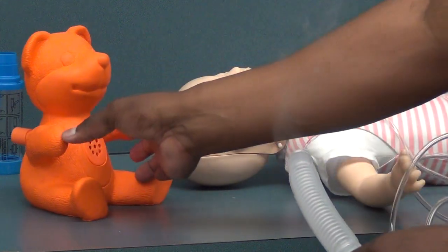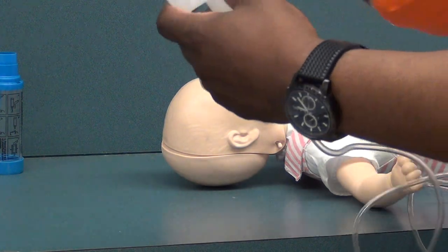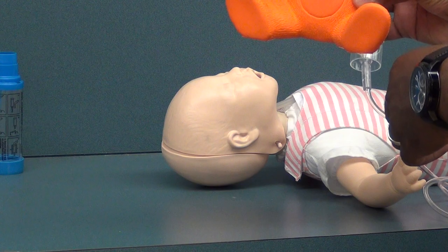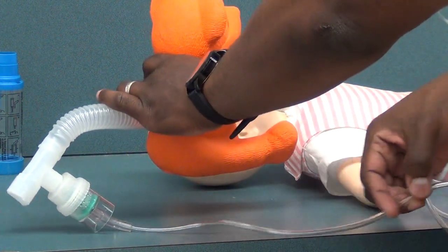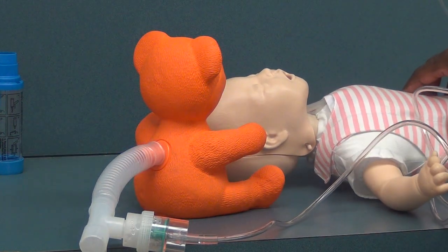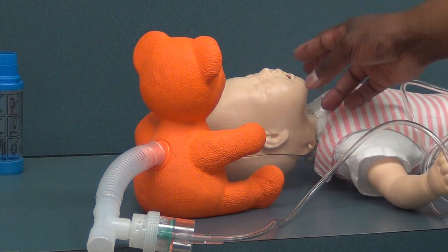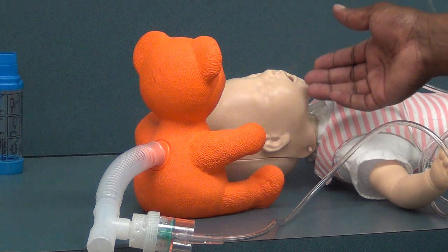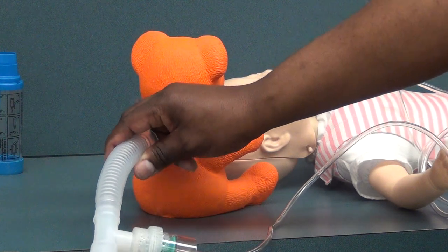Additionally, using our teddy bear device, we have an attachment on the back where we can place our tubing. Turning it around, notice how the mist — the medication — actually comes out of the opening. This is a clever tool; we place it as close to the baby's mouth and nose as possible so that you can see that layering effect and the baby would actually receive their medication. Most babies have their heads turned either left or right, so make sure you position the baby's head accordingly when using some type of assistance device.